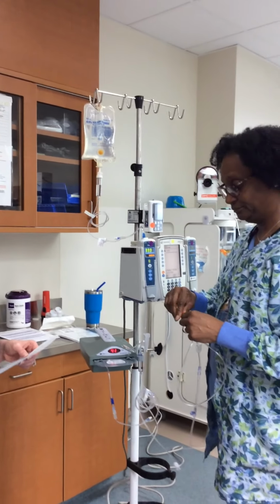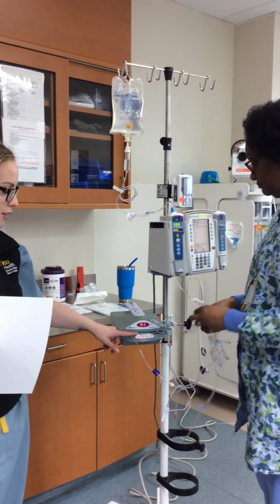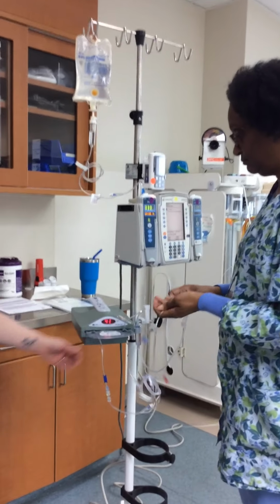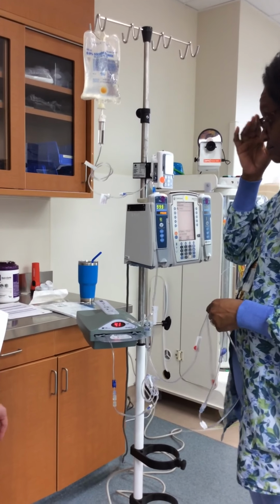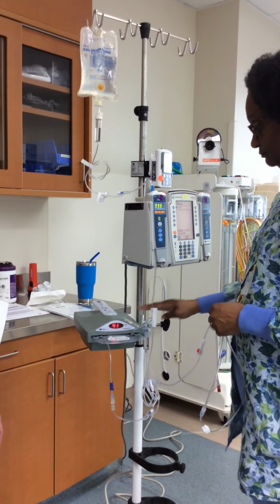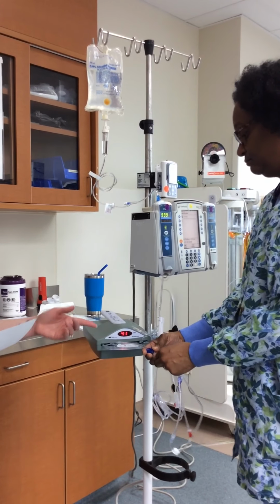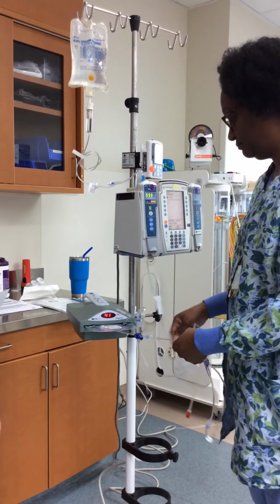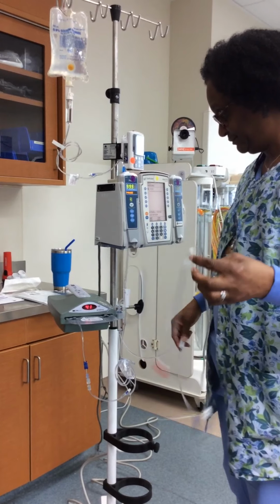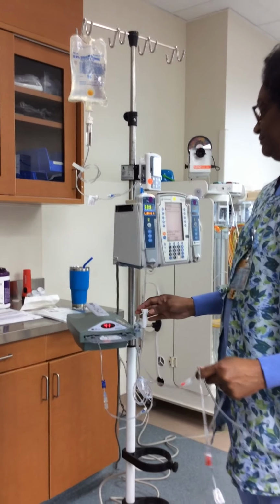And what we'll just talk about really quickly here is when the infusion is done, remember that you must empty fluid out of this cassette to be able to pull it out. If you attempt to pull it out with fluid inside, it will not come out. If you get aggressive with it and yank on it, you could pop the cassette and the fluid's just going to go everywhere. So what you need to do to be able to remove the cassette is to let out a little bit of fluid. You're going to clamp your blue clamp, and then you're going to let a little bit of fluid come out. They say approximately 2 to 3 mLs is what needs to come out before you'll be able to gently remove the cassette from the Ranger.